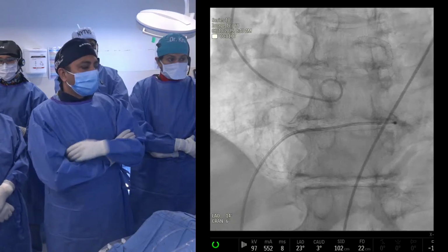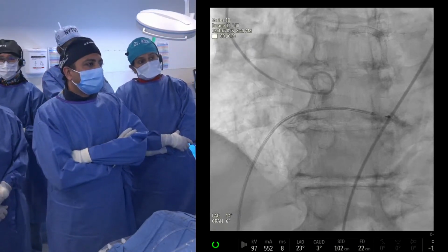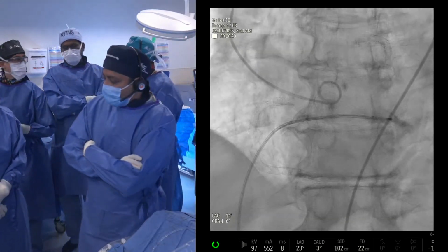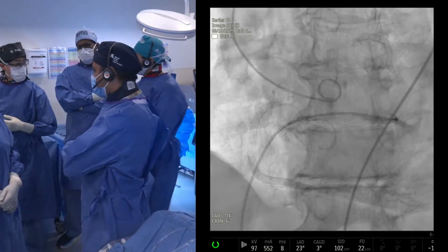If he was a little bit younger, with more chance of degenerative CAD happening, then probably go with the balloon expandable valve. Now with 26 and with 1 or 2 less cc's, don't you think you'll get a better sealing? No, you will. That's what I mean.